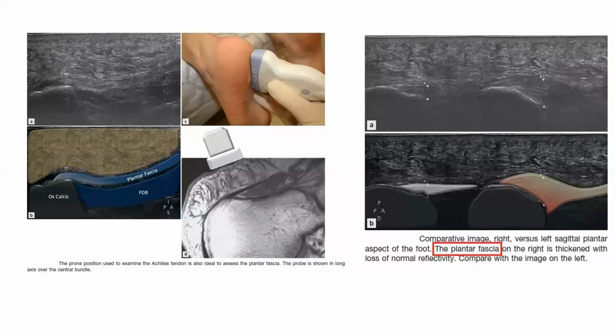I usually tear that, and I fold the glove, and in the folded portion I put lignocaine jelly and put that probe, and then use the rubber margin of the glove to fix it. So that is one of the cheap and best options. In the next class, I'll demonstrate how to use the normal surgical glove as a probe cover, which is sterile, cheap, and best.